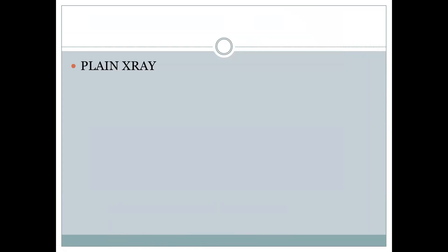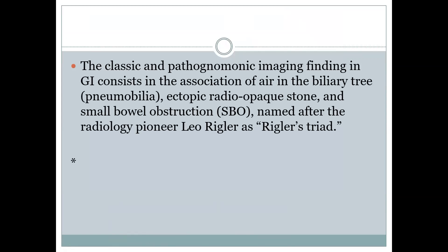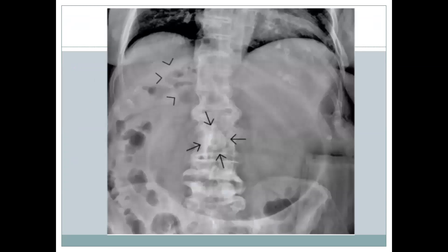Now I will discuss some findings seen on a plain abdominal X-ray. What we look for is known as Rigler's triad, which consists of air in the biliary tree, an ectopic radiopaque stone, and features of small bowel obstruction.